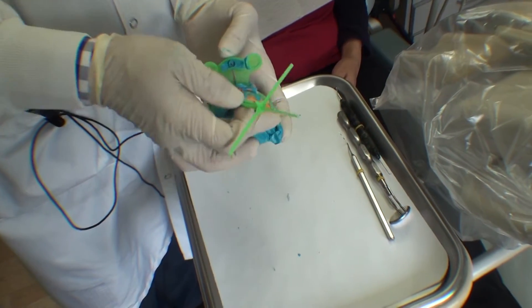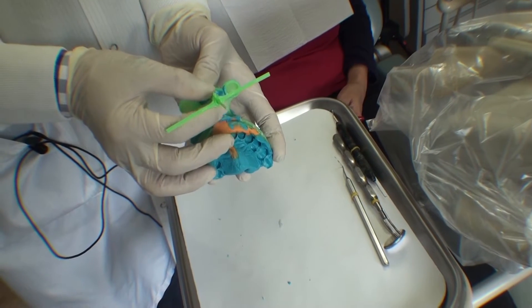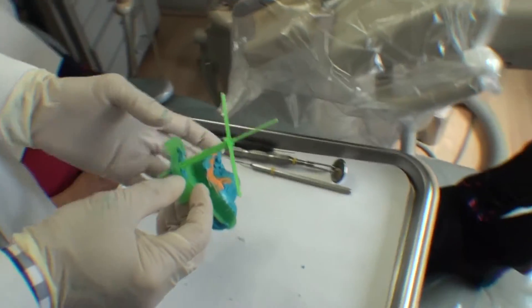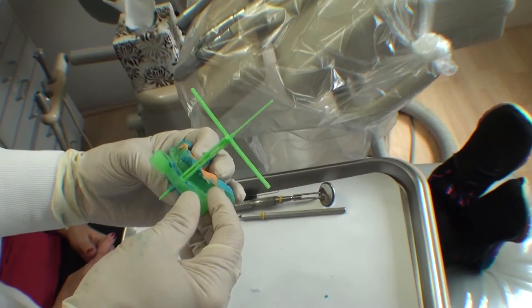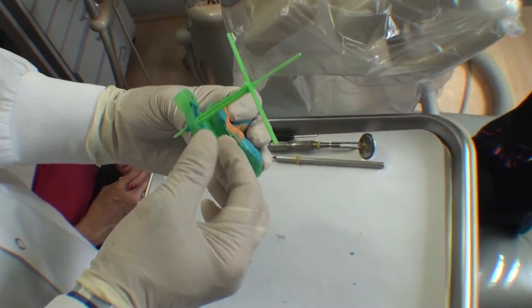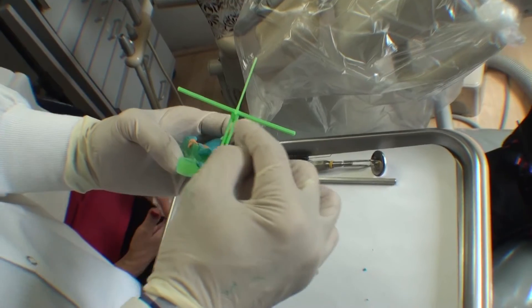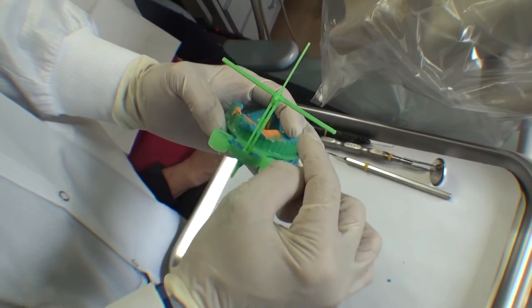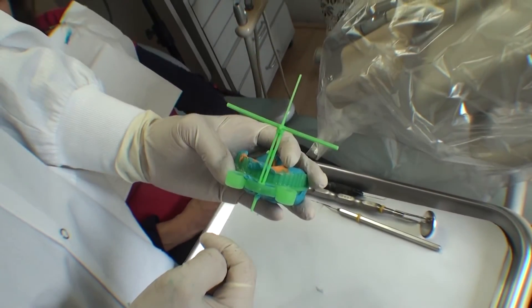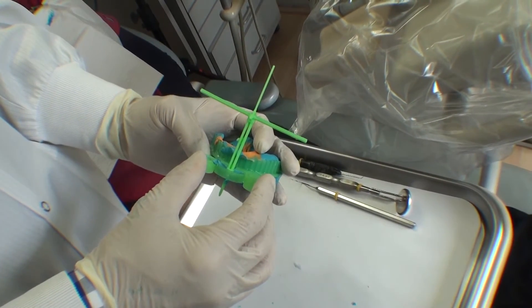The second thing the technician will do after the model is poured up is to reinsert the cross onto the tray. Imagine the models are poured up and articulated and the cross is inserted. The technician would then use the cross to mark on the working models the horizontal as well as the vertical midlines, which acts as a guide when he does his wax-ups.